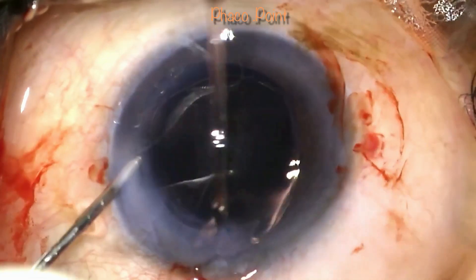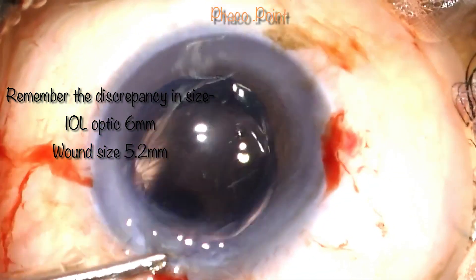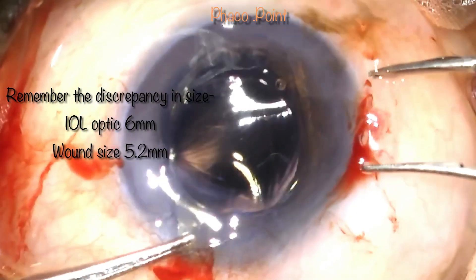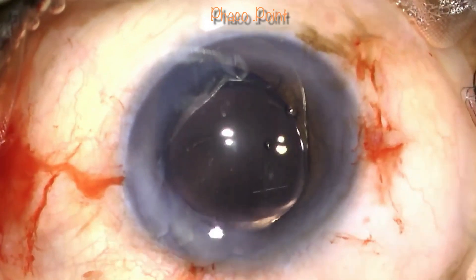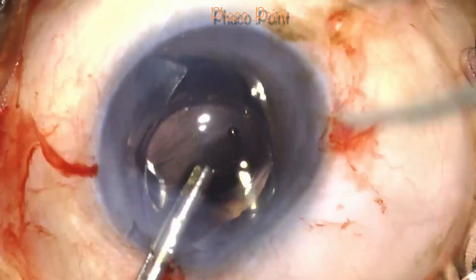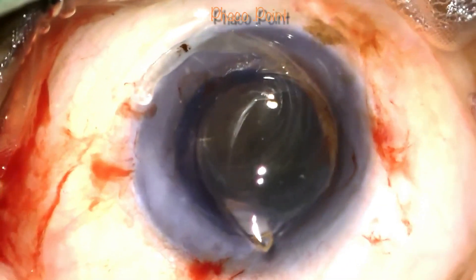My first attempt at removing the IOL fails. Note how I hold the IOL at the optic-haptic junction very proximally and try to bring it out of the eye — I am not able to exert the correct amount of force required to pull this optic out through the 5.2 mm incision. Here is the correct way of doing it: under adequate viscoelastic, a well-opposed Macpherson's forceps is introduced into the eye, making sure it holds on to a large portion of the optic. Only then can you exert the correct amount of force to successfully and comfortably remove it from the eye.